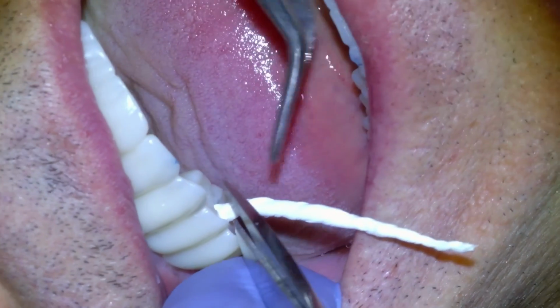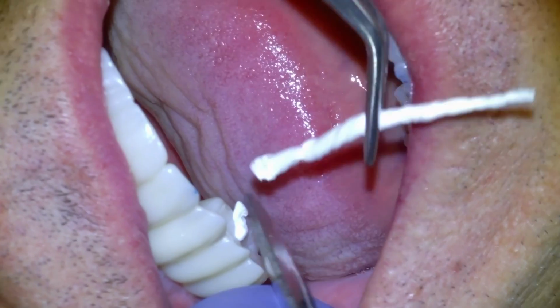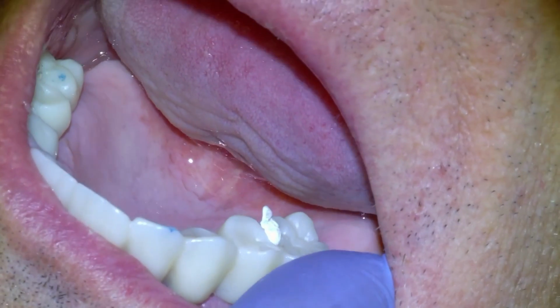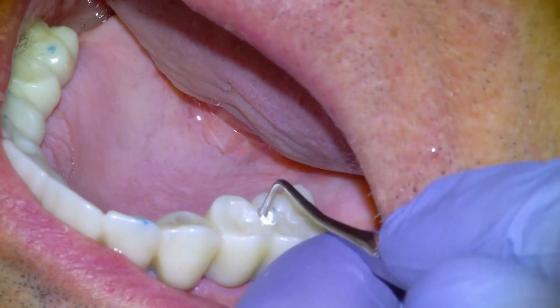So these things are retrievable, but they are fixed. They're not removable. They're in there solid. You can grab these things and shake them around, and they don't go anywhere.